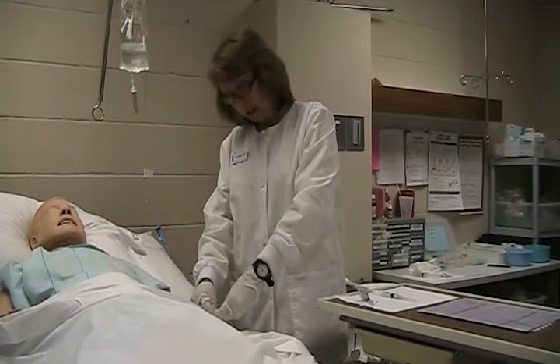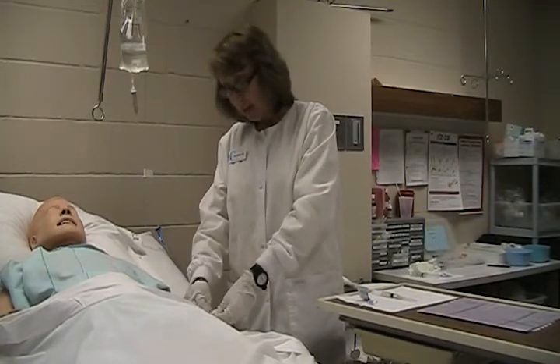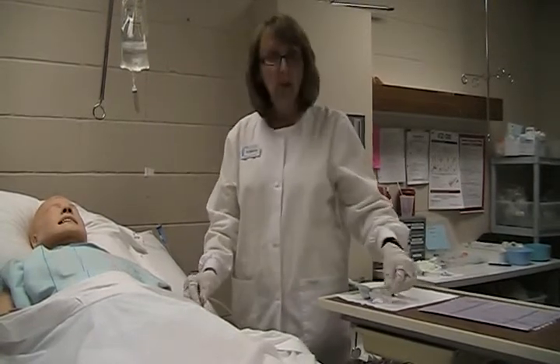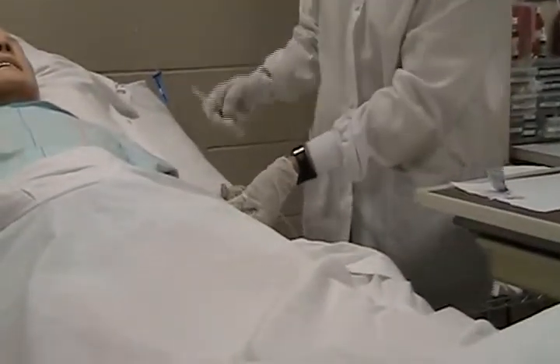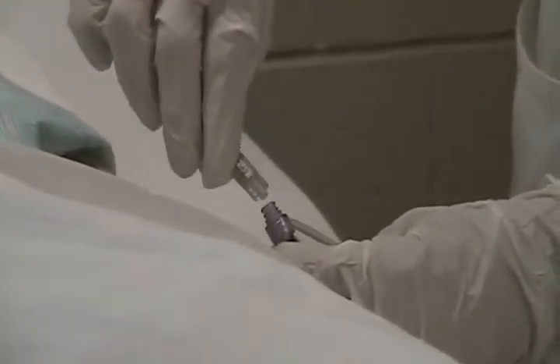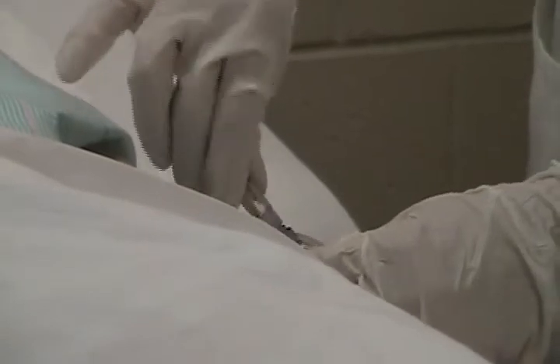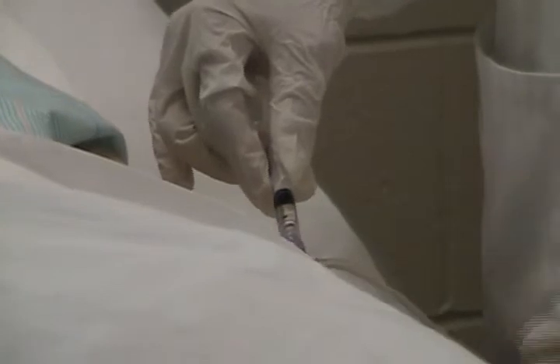Cleanse the hub of the injection port closest to the patient's insertion site, remembering to cleanse it thoroughly for 15 seconds. Allow to dry. While stabilizing the port, get your syringe with the medication and prepare to secure it to the injection port using a twisting motion. I am now ready to administer the medication.